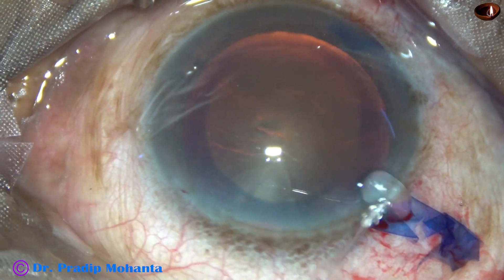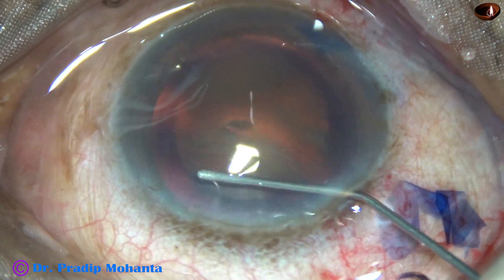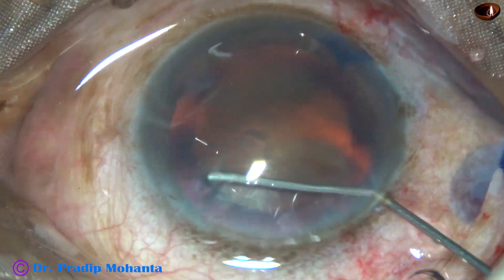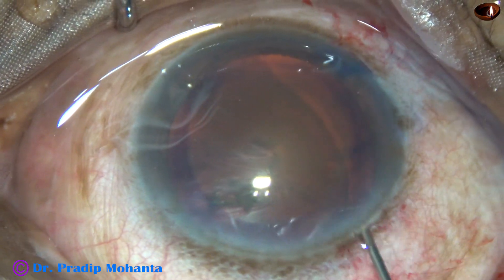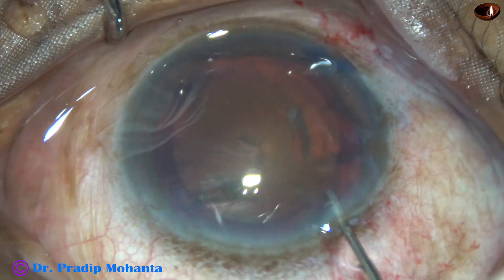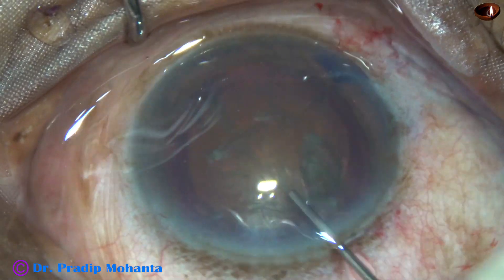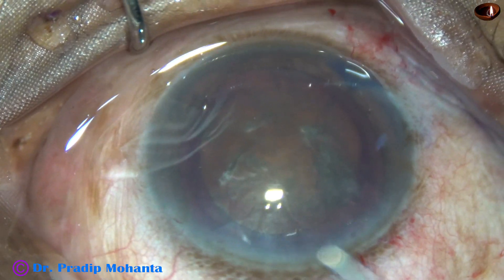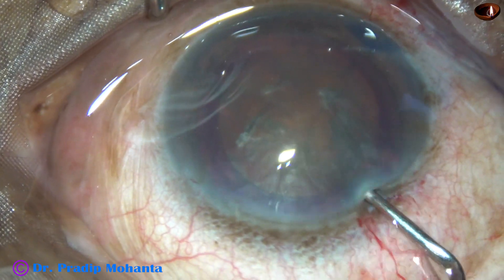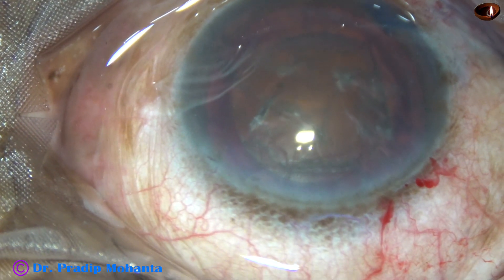And now hydrodissection. This is a 27 gauge cannula and BSS is being used for hydrodissection. Hydrodelineation is not attempted in such hard cataracts — it will never happen. And now again viscoelastic, this is 2% hydroxypropylmethylcellulose.